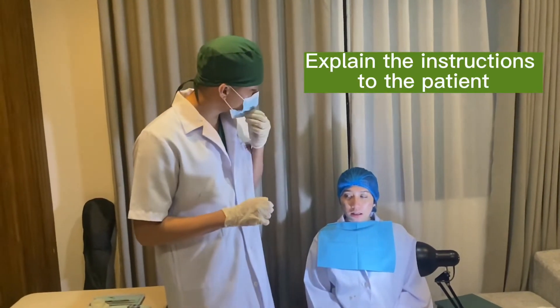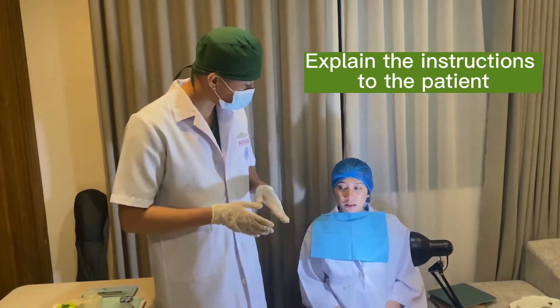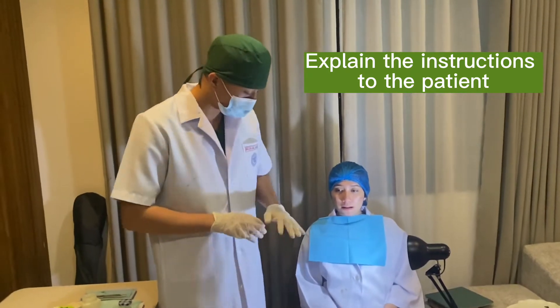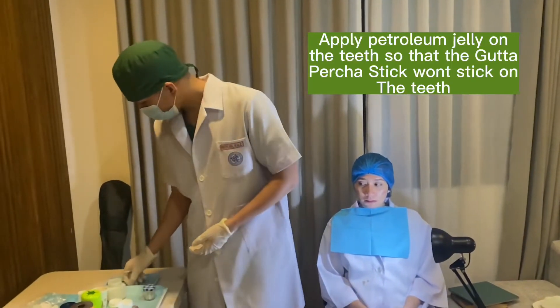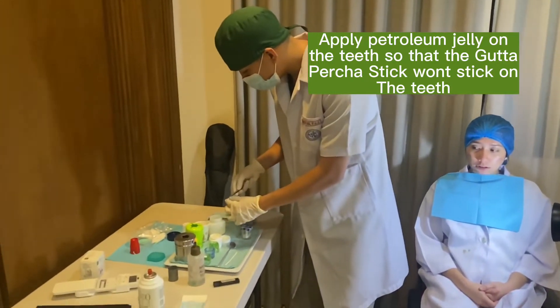Now I will be putting something hot on your teeth. Just like in the cold test, raise your hand if you feel any pain or any sensitivity. Don't be alarmed — if you feel any sensitivity or pain, please raise your left hand.